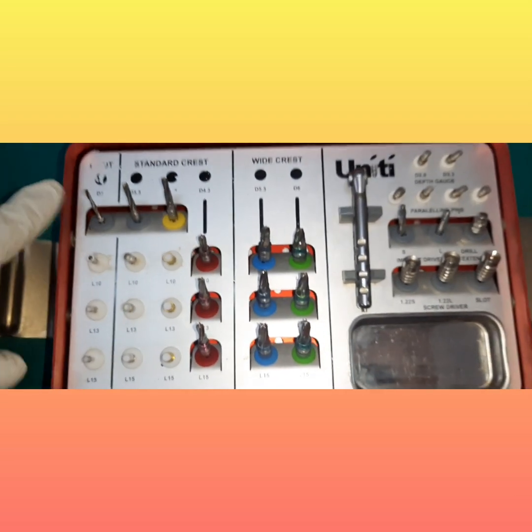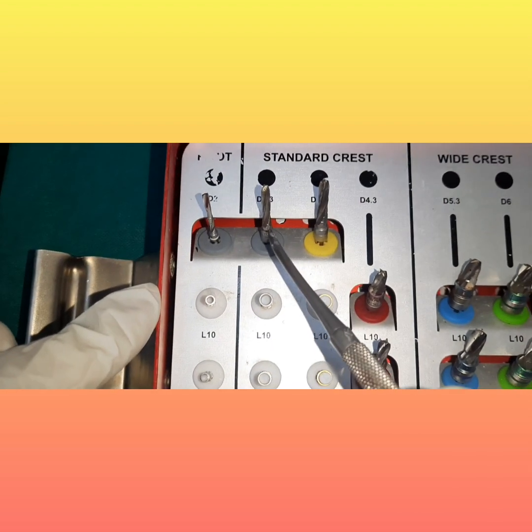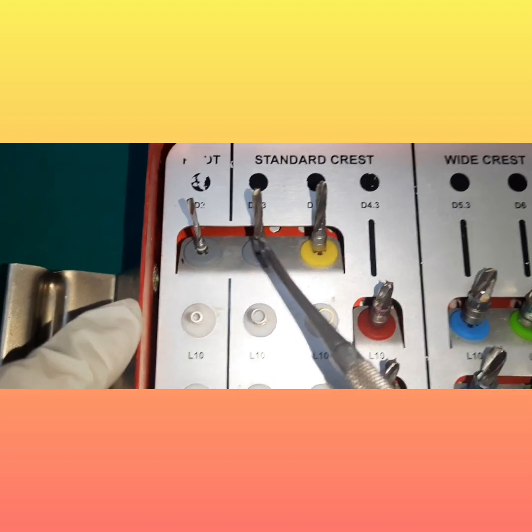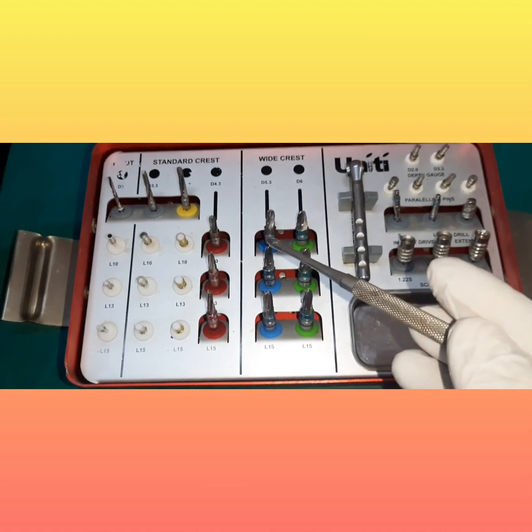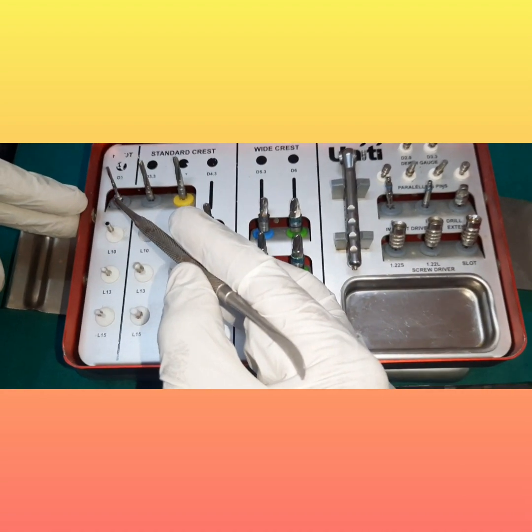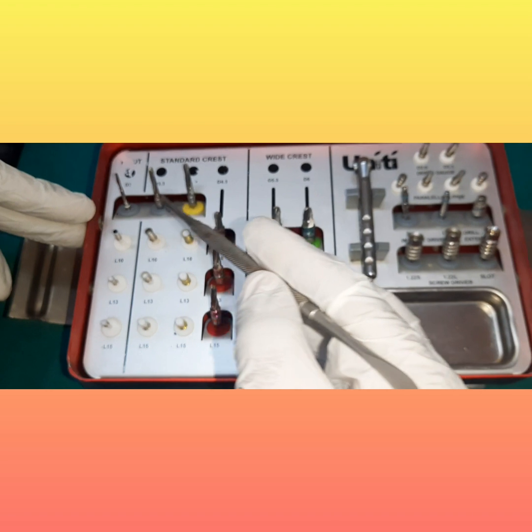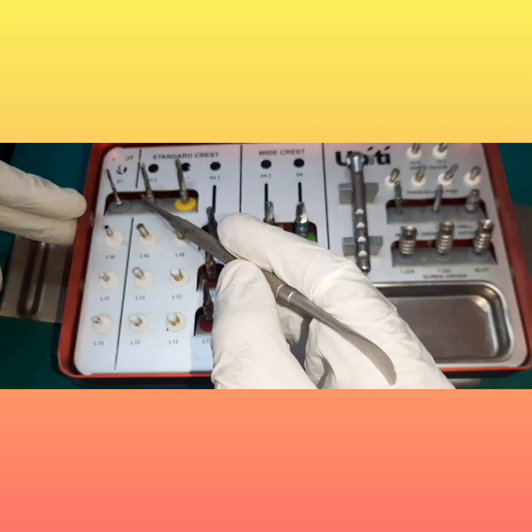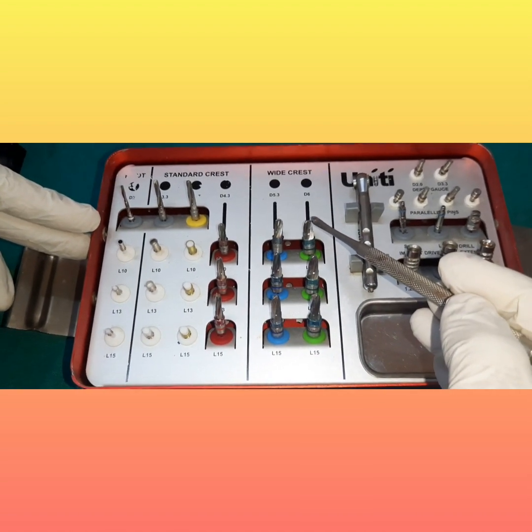Next we'll take the pilot drill. Now I'll just tell you what the drills are. This is the pilot drill. These are various drills according to the size of implant which you want to place. So this is one kit which I was having. I am just showing you according to that, although the procedure of placing an implant is similar and universally followed. So you have the pilot drill first, and then you have the consecutive drills depending on the type or the size of implant which you want to place, like D 3.3, 3.7, 4.3, 5.3 and D6.